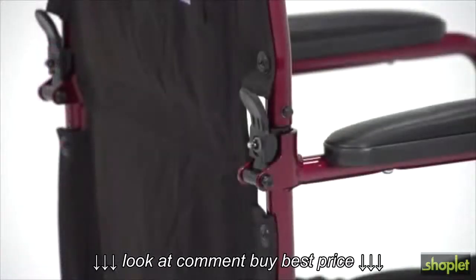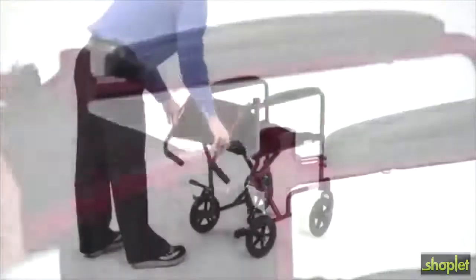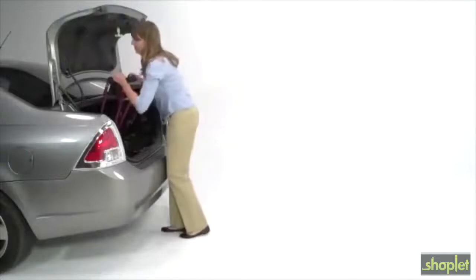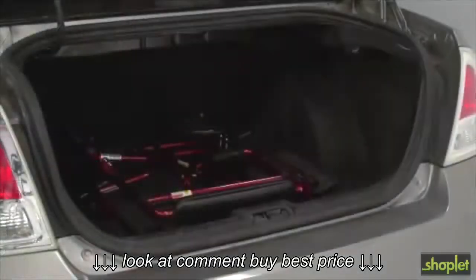To transport or store the chair, pull locks simultaneously and carefully fold down the back support. Then pull up the side seat straps. Weighing only 19 pounds, the chair's light weight makes it easier to load and unload into a vehicle without difficulty.